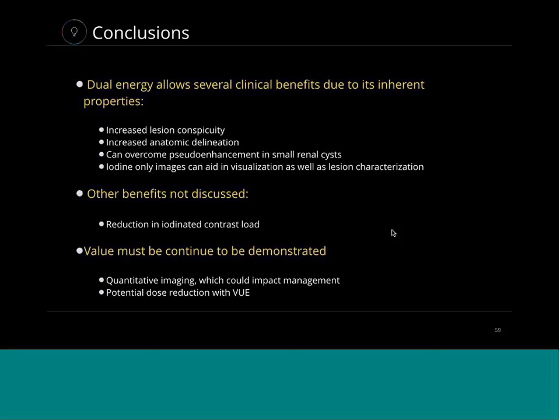I want you guys to know that when you're scanning in dual energy mode, I want you to know what the downstream effects are. It's important that the workflow is optimal, not only for us, but for you guys as well. It's got to be easy for you guys, and it's got to be intuitive for you guys, okay? And there's a few things that you should know. Patient centering is critical, making sure that patient's appropriate for dual energy, and quite frankly, dual energy should be the default. If you know that these are the advantages, why wouldn't we give the patient this benefit, right?